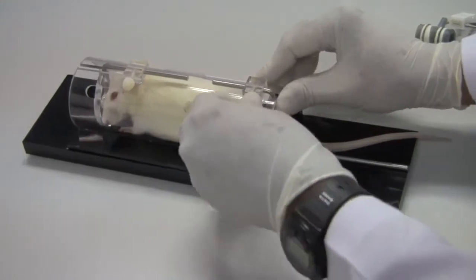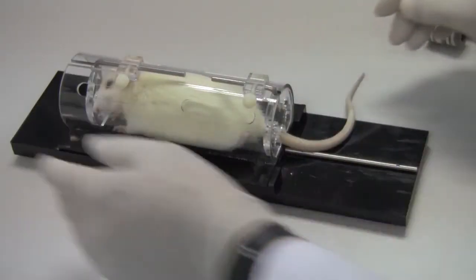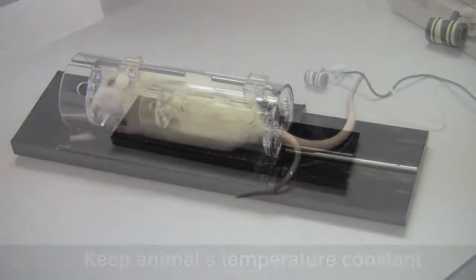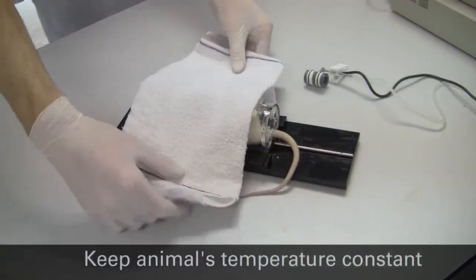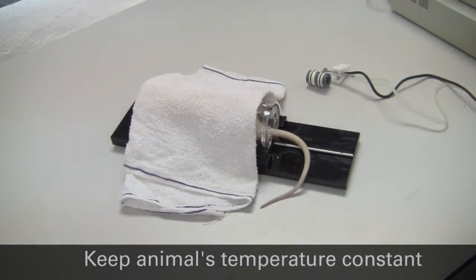Once the rat has been introduced into the restrainer, the length of the restrainer can be adjusted to comfortably restrain the animal. A towel is placed over the restrainer to help calm the animal, and a lamp is placed close by to keep the animal warm.